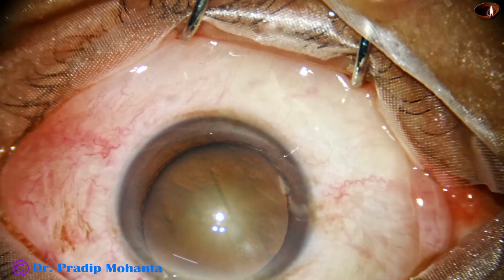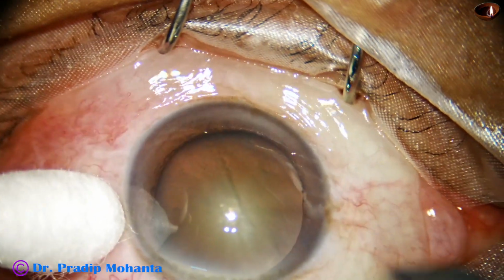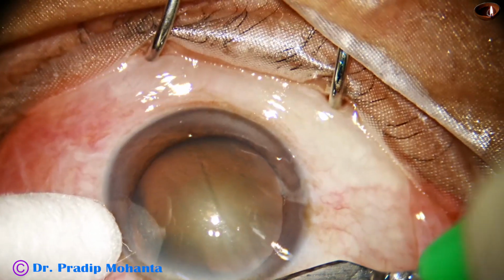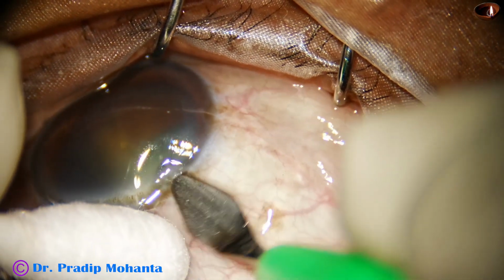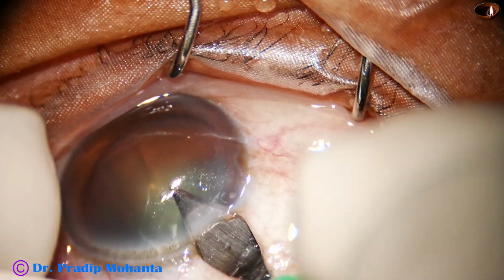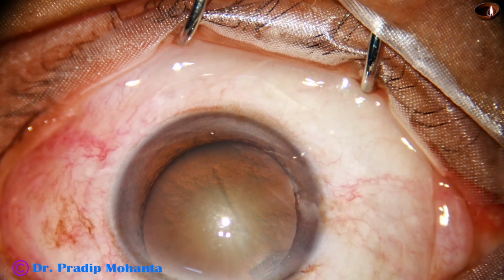Friends, this video is running at 75% of the normal speed. That means it is running in slow motion. I have deliberately made it slow so that you can give inputs about how and when the rent occurred. So the main incision is made.